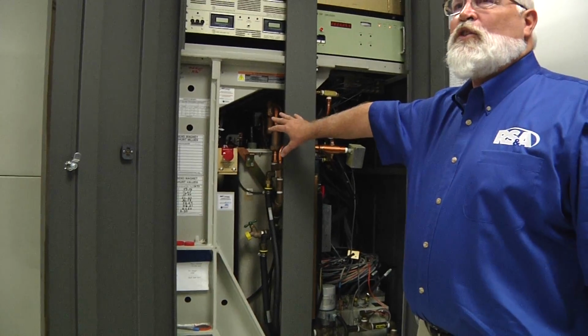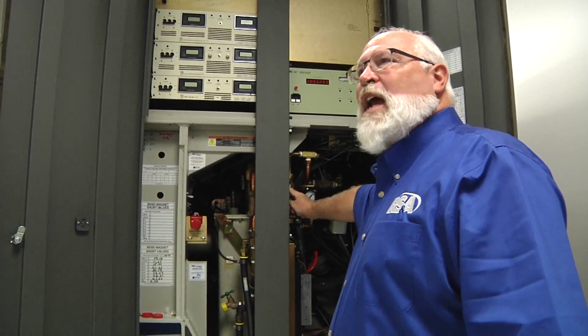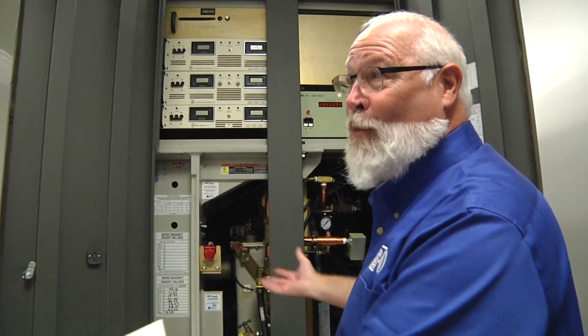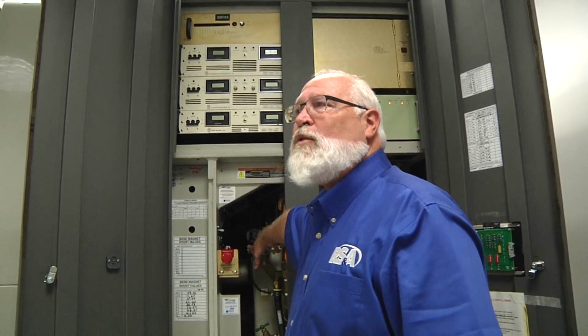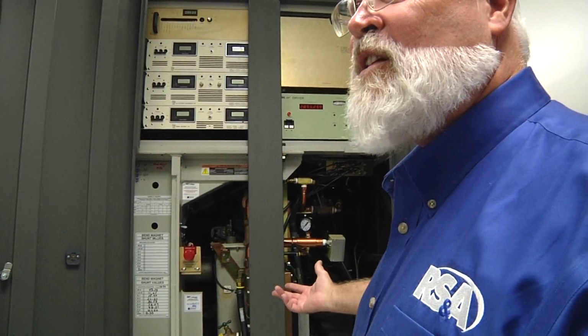So for you guys, you'll always check in the morning. You're going to check some temperatures up here, and the temperature gauge is on this one. On a Kona stand, it has a little gauge right here, usually a window in the door, so you don't have to open things up. But if your water is low, you're going to have to fill the water up. You'll get a water interlock or flow interlock where it shuts your pump down if the water is low. So that's one thing we ask you to check.